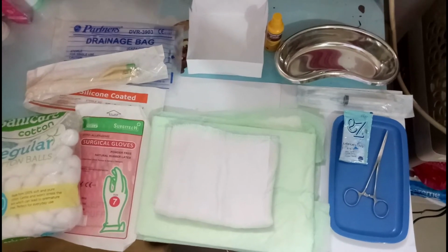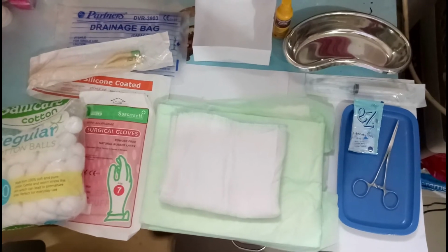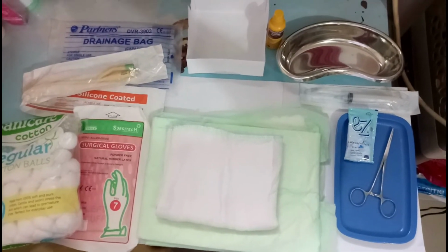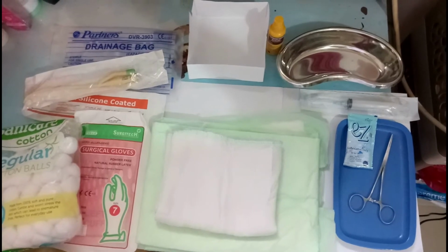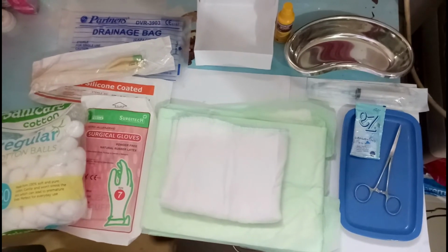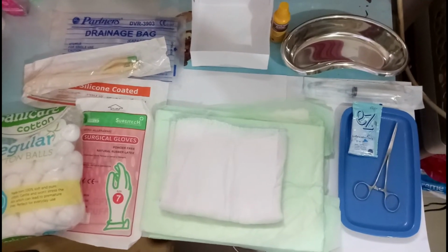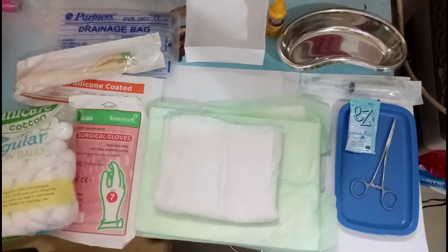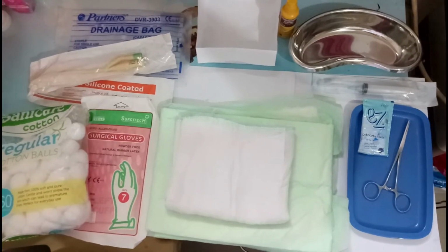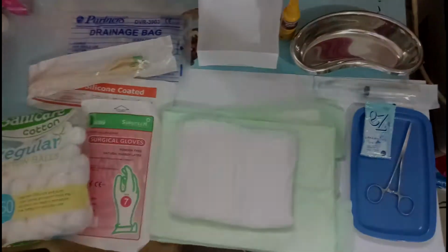And now I'm going to gather the equipment needed for the urinary catheterization. I have already prepared my equipment. I have here a cotton ball, surgical gloves, Foley catheter, drainage bag, waste receptacle, betadine solution, lubricating jelly, a drape for the patient which I prepared and will keep sterile, a kidney basin, medicine tray, and also a Kelly forceps tray. So now let's start and meet the patient.